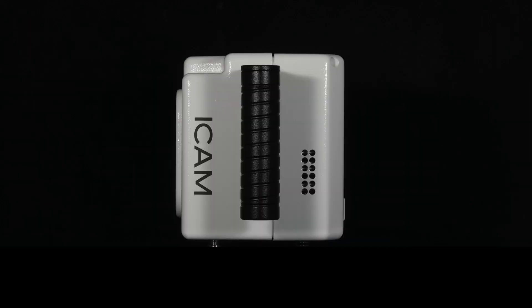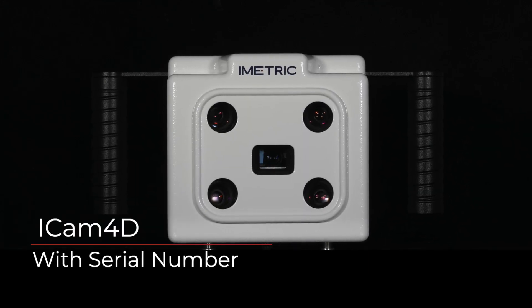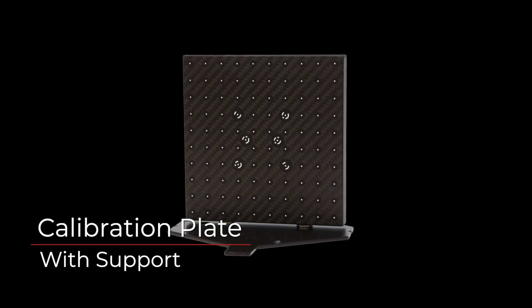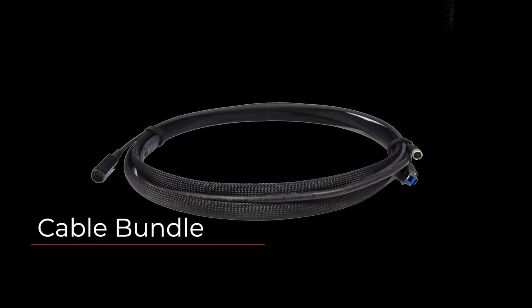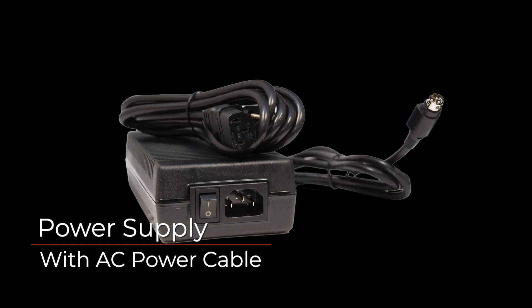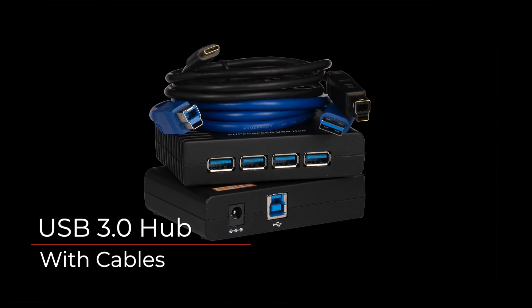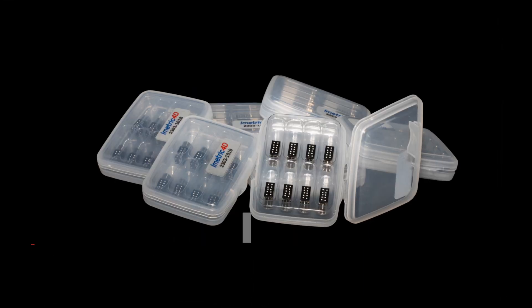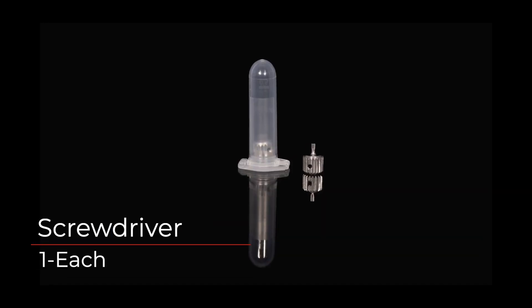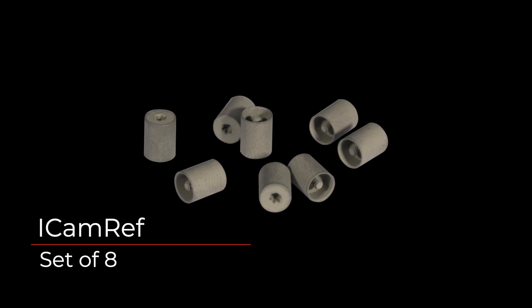Let's identify each component of the DEN sheet provided in the shipping materials. First off you will have the iCam 4D with the serial number, the calibration plate and the calibration plate support, the cable bundle, the power supply, the AC power cable, the USB 3 hub with its cable, an iCam body set of eight, iCam body screws, a screwdriver, and an iCam ref set of eight.